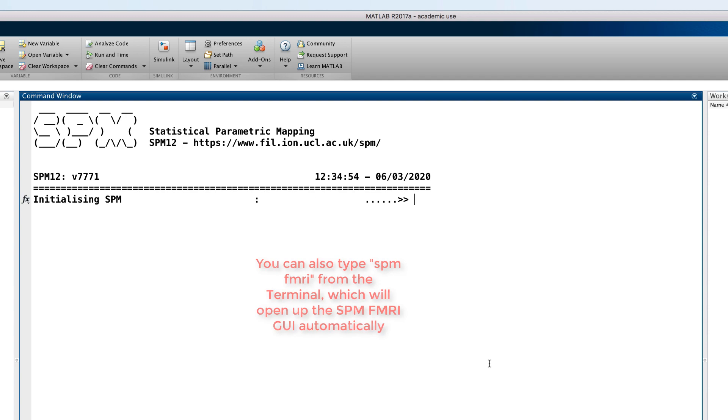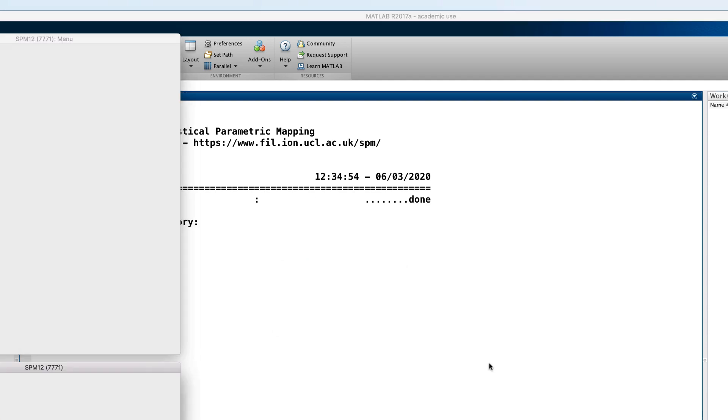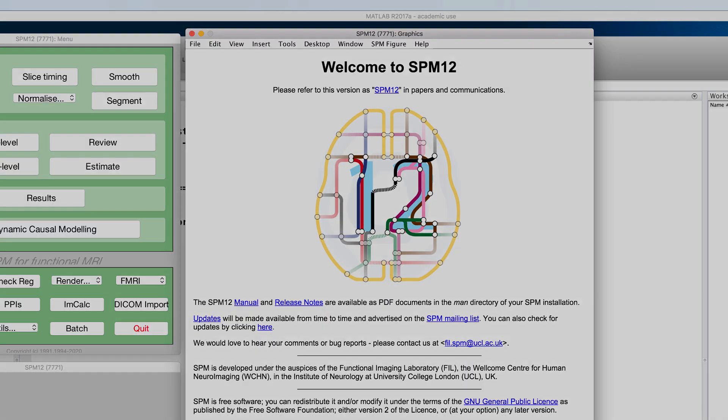When you're finished with it, it should look something like this. And that's it. You're now ready to download a real data set and analyze it with SPM, which is what we now turn to.